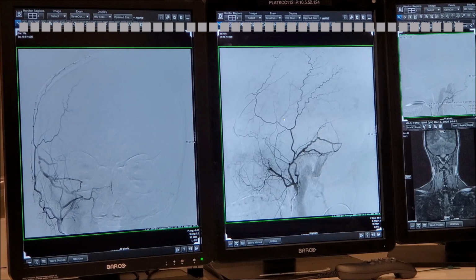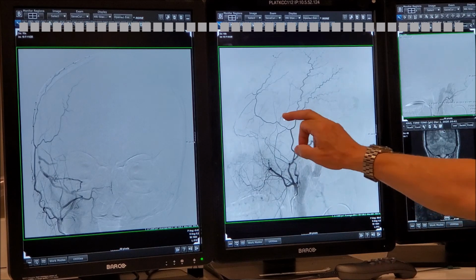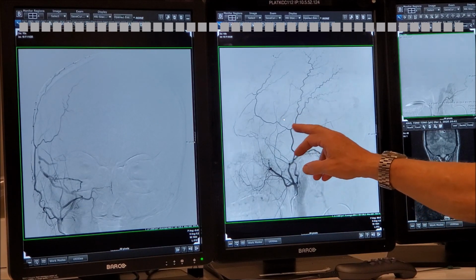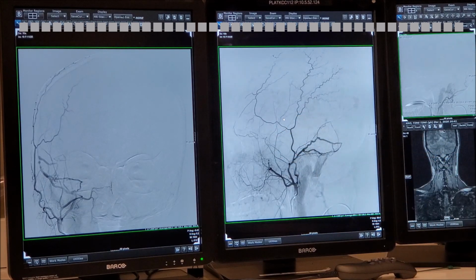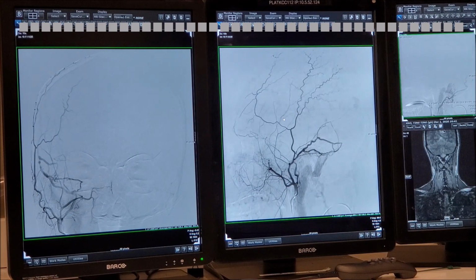There is no cortical venous drainage, which is the most dangerous. And within the cortical venous drainage, if you have bumps and lumps, you will see patients with dural fistulas that will bleed here because the venous drainage goes there. And many times when it goes through the tentorium or something, maybe a restriction, that's where they balloon out. So this one is, I would say, type 1, benign.